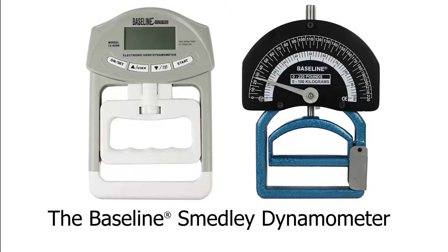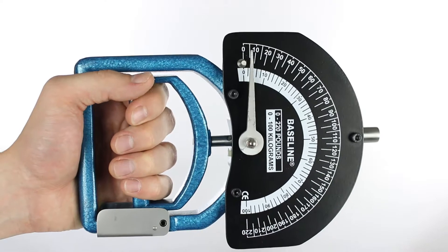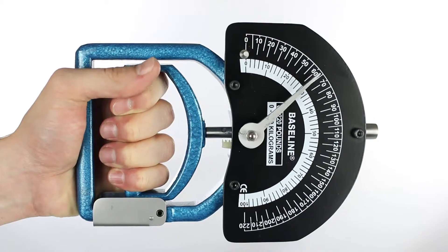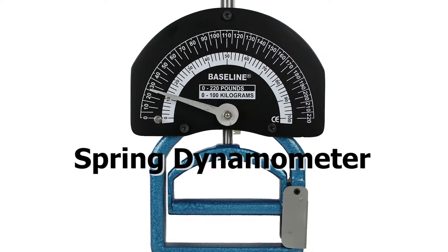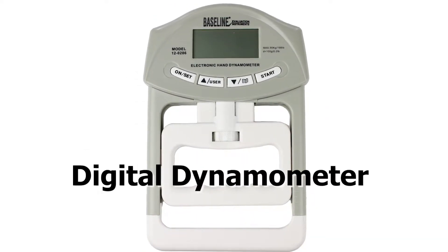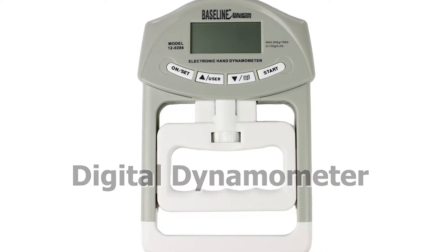The baseline Smedley dynamometer gives accurate grip strength readings. These devices are used to measure a baseline evaluation so that a therapist can set a plan of care. The progress of this plan can be measured with a dynamometer for the remainder of the rehabilitation program.